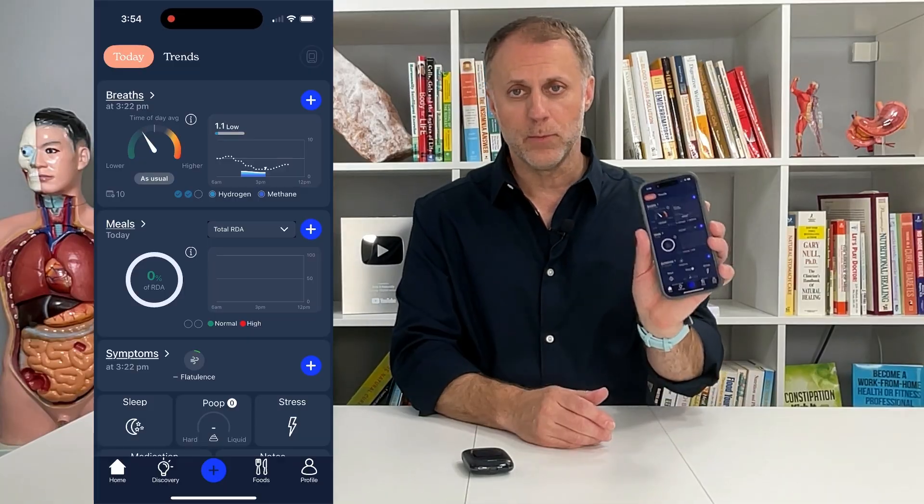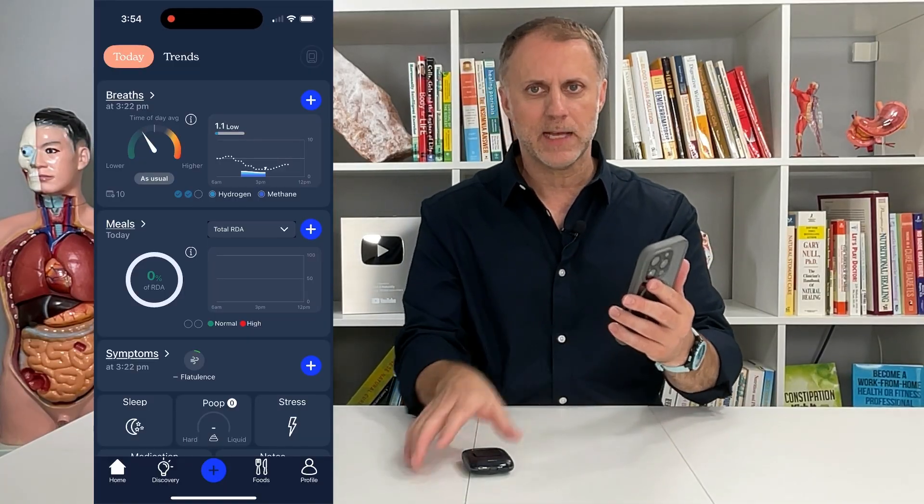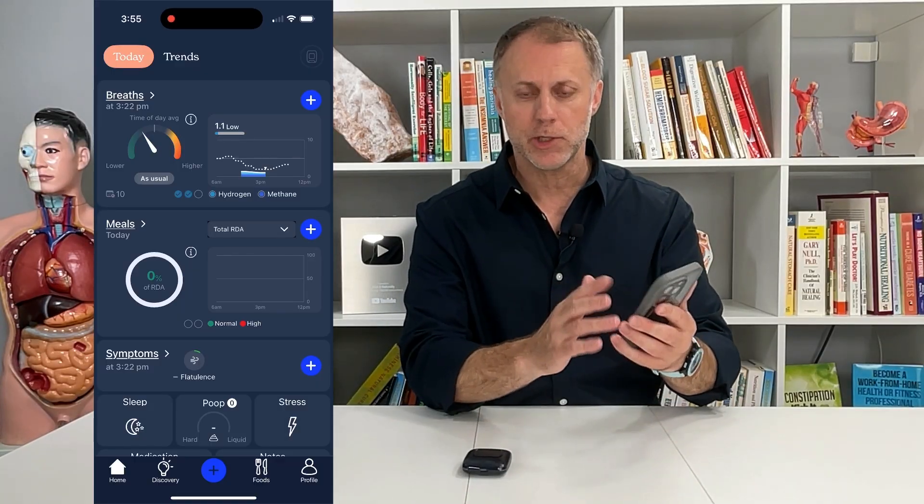First of all, you have to have a smart device where you can download an app from any app store for the Food Marble. It's a nice app — you can put in your breath tests from this device, but also the foods that you're eating and symptoms that you're having.